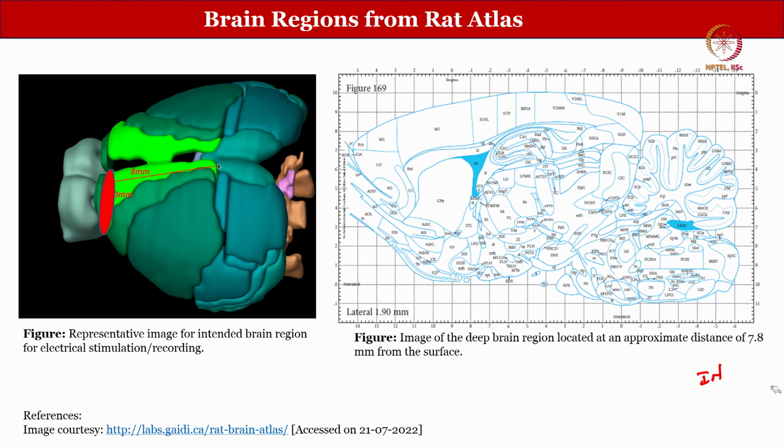If you try to understand how the brain atlas looks, it is not so easy, at least from the engineering perspective. It will take some time for us to understand which area is what. But in the bigger picture, we want to understand what happens when we apply electrical stimulation on the surface versus deep down in the brain, and the effect of that on the motor area.